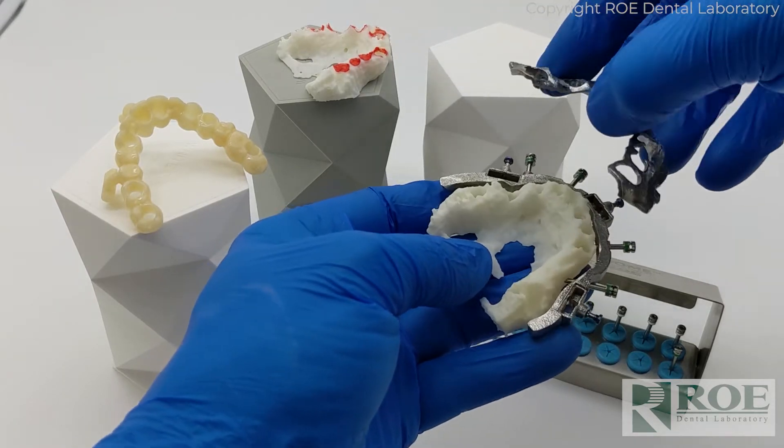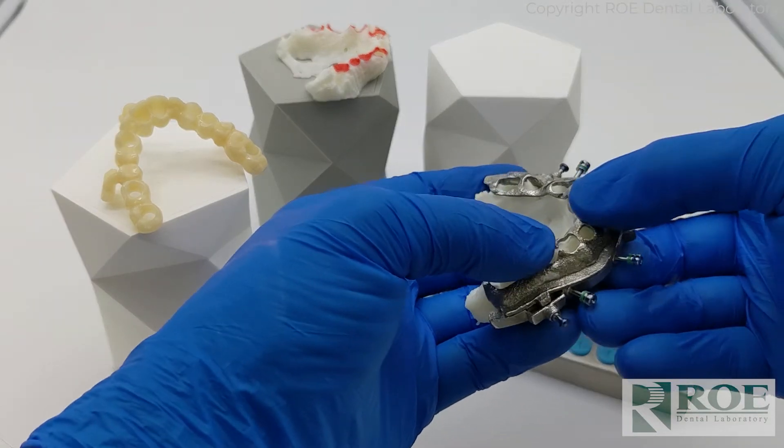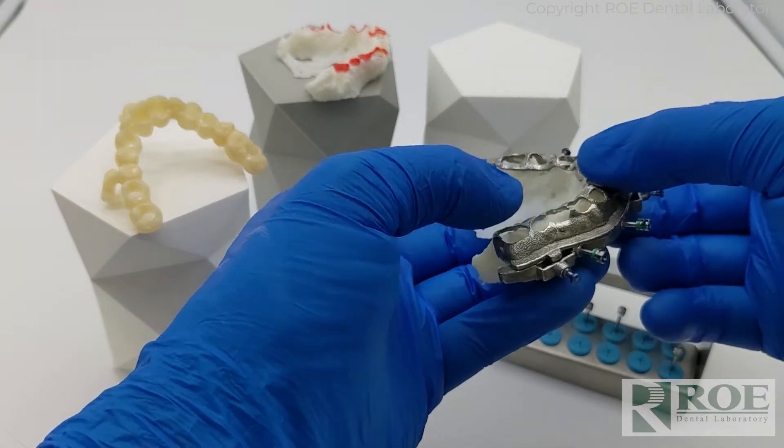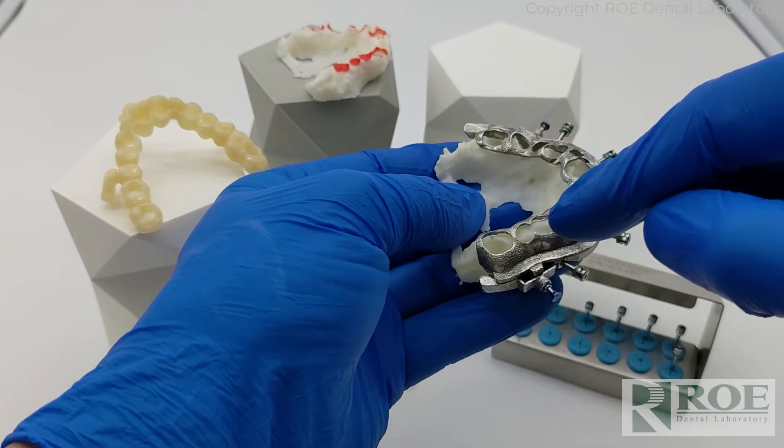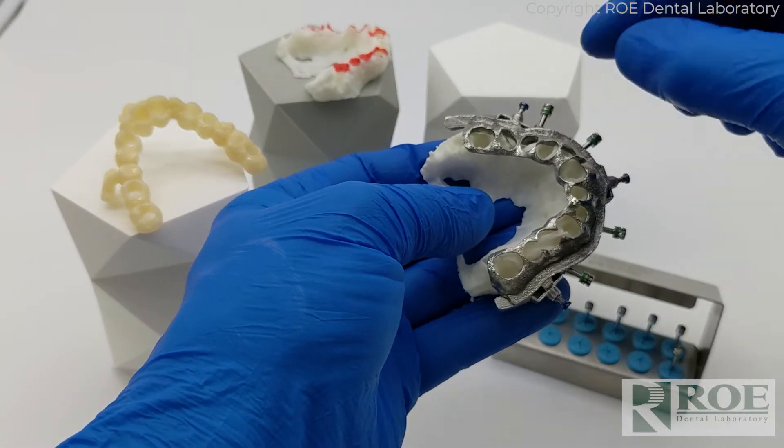Even before we adjusted, the scallop guide seated and pinned and was passive, but we still needed to make some room here for a pontic. We had to open up, as you can see here, which kind of mirrors the two.